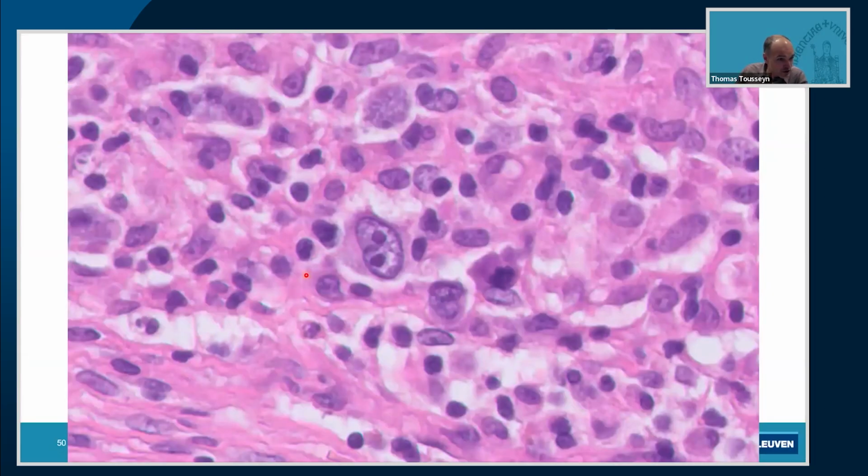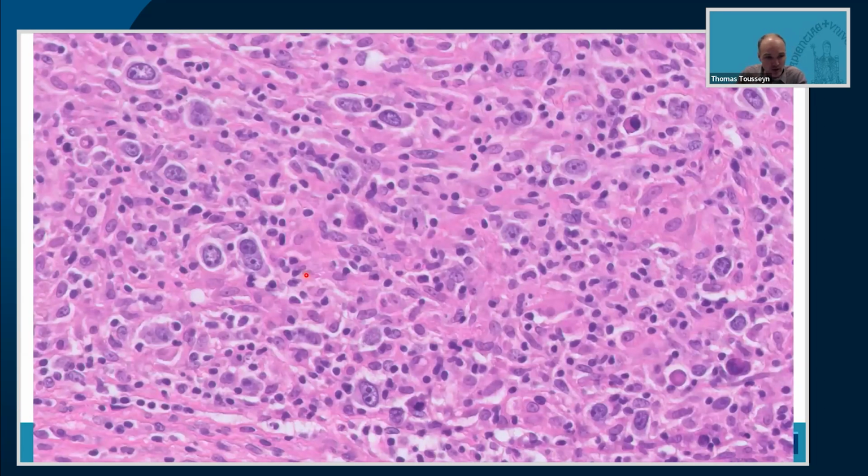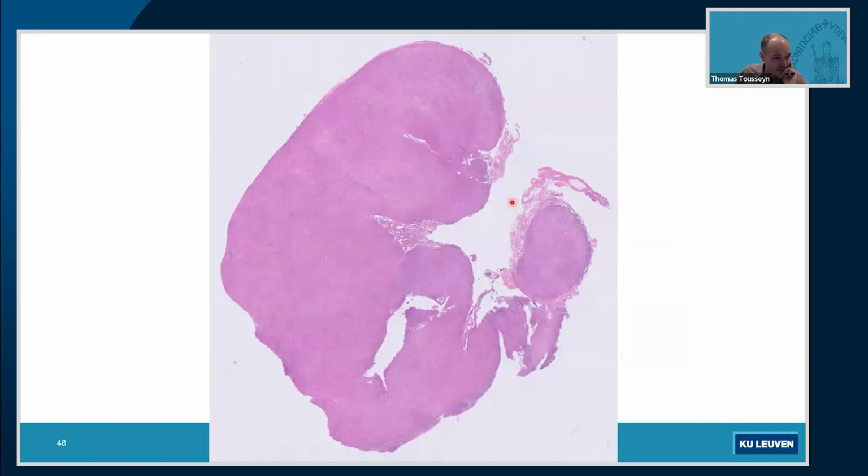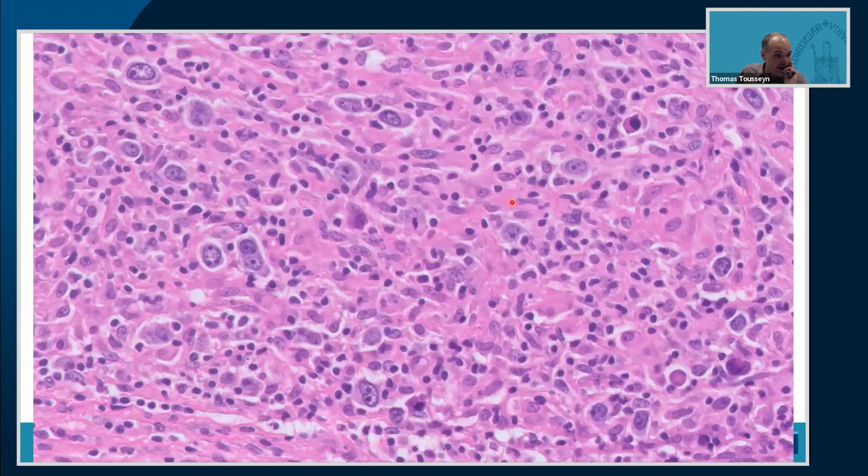it's mainly because we saw several cases two webinars ago. So webinar 5, we saw a case. This is a post-transplant patient with abdominal pain with lots of lymph nodes in the abdomen with a disturbed architecture and with an image that looked like this, with these large atypical cells, some clear binucleated Reed-Sternberg-like cells. And the background now is not only T lymphocytes, it's mainly histiocytes and very epithelioid histiocytes.